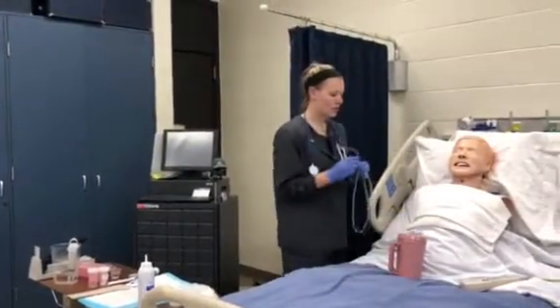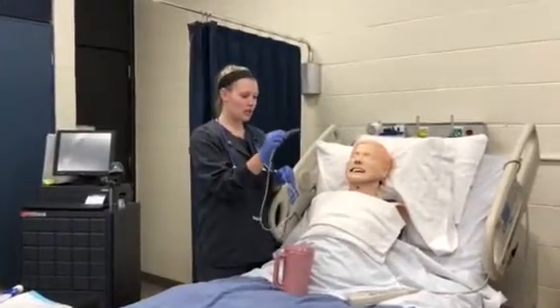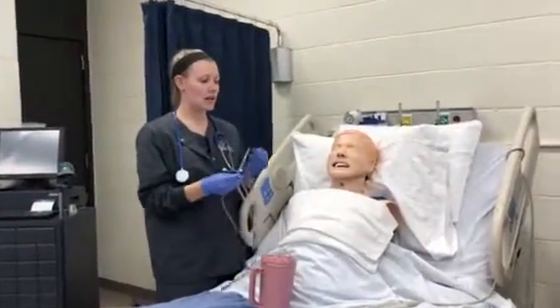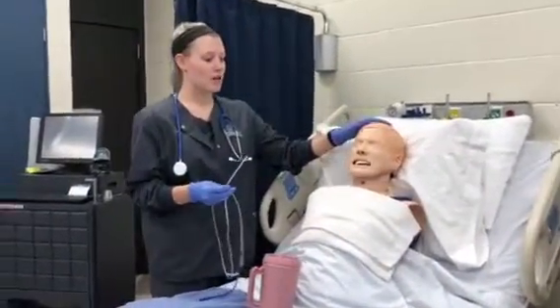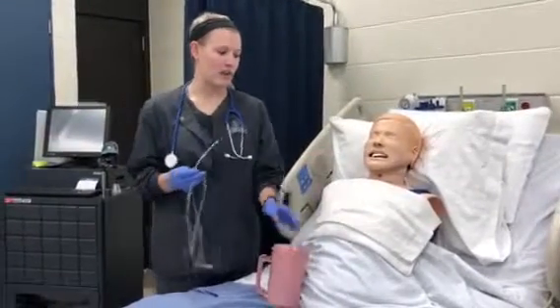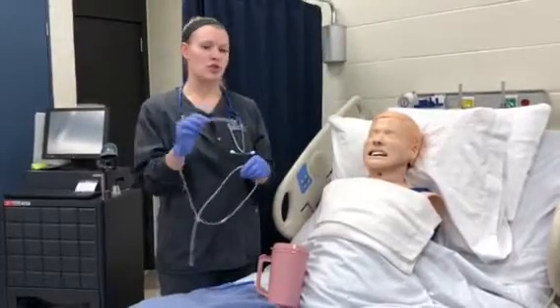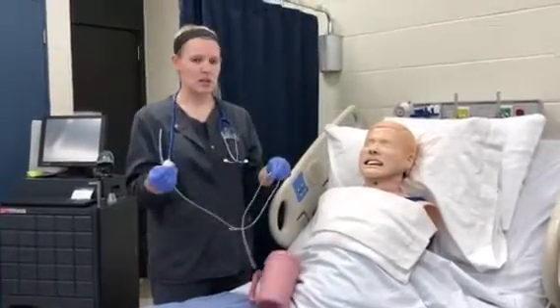So what the patient's going to do is they're going to hyperextend their neck back, and I'm going to insert the tube in their nose. Once I hit their oropharynx area, I'm going to have them put their head down, and then I'm going to give them some water, and every time they take a sip of water, I'm going to advance the tube 2 to 4 inches until I meet my mark.